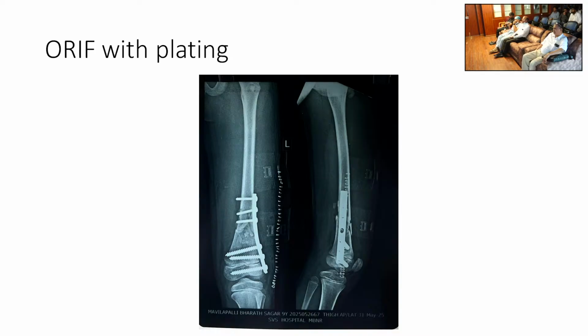Theoretically speaking, it is supposed to maintain the distance between the distal most and the second screw from the bottom. Then it will not be allowed to grow. It gets compressed, that's what the medial column will be compressing over the growth cartilage. That's the problem. You'll have to remove it immediately.